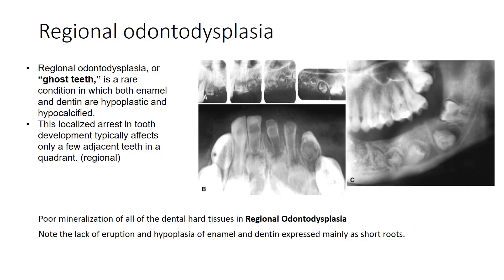Regional odontodysplasia, also called ghost teeth, is a rare condition in which both enamel and dentine are hypoplastic and hypocalcified. There is a localized arrest in tooth development typically affecting only a few adjacent teeth in a quadrant, hence the term regional odontodysplasia. The radiograph shows poor mineralization of dental hard tissue structures, lack of eruption, and hypoplasia of enamel and dentine expressed mainly as short roots.